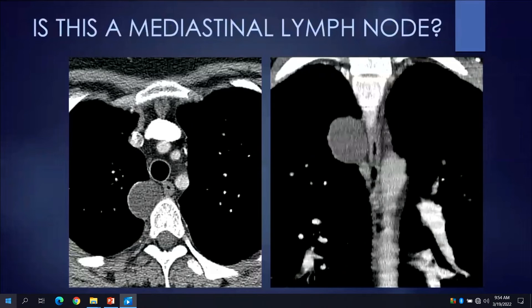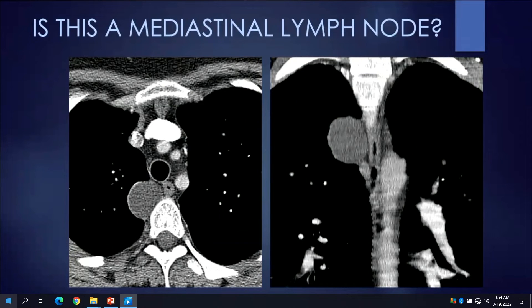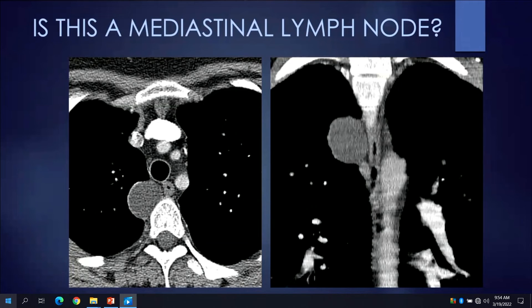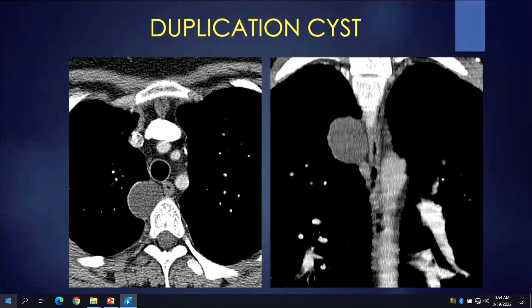Is this a mediastinal lymph node? We see a very well-circumscribed, roughly round-shaped structure with very low attenuation measuring in the Hounsfield units of water. In this particular case, we might mistake this for a mediastinal lymph node, but it actually represents a different type of mediastinal mass — in this young individual, it is a duplication cyst.